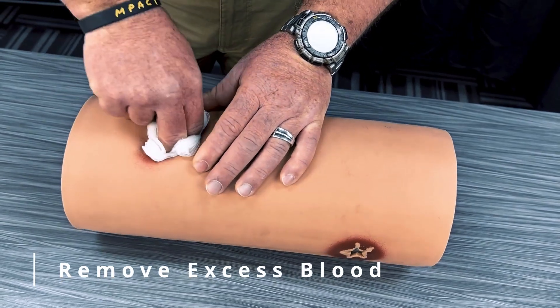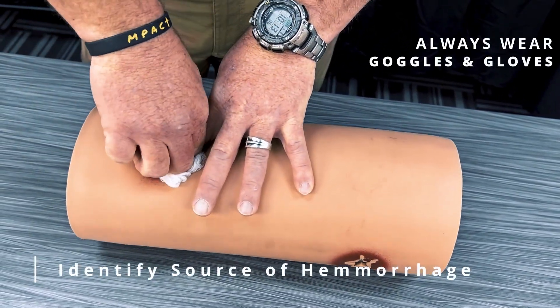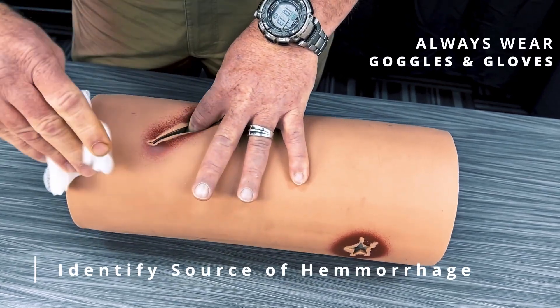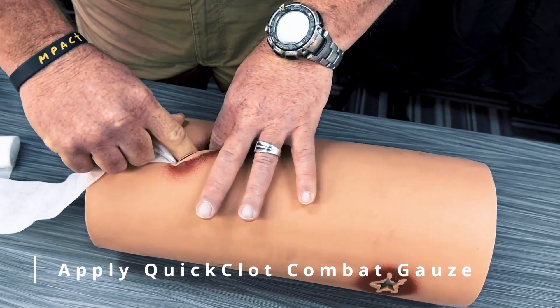First, remove any excess pooled blood from the wound cavity using 4x4s. Determine the source of significant hemorrhage within the wound. Pack the quick clot combat gauze directly onto the bleeding source.